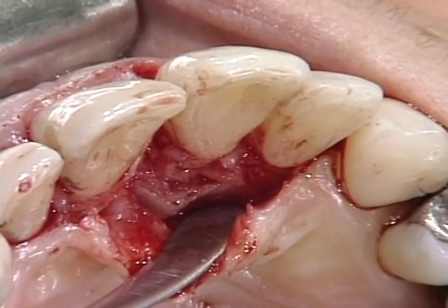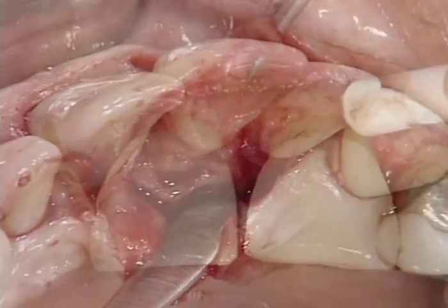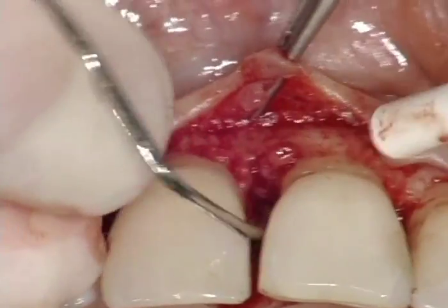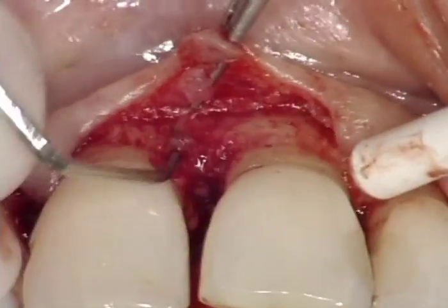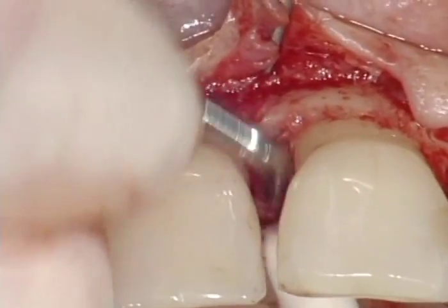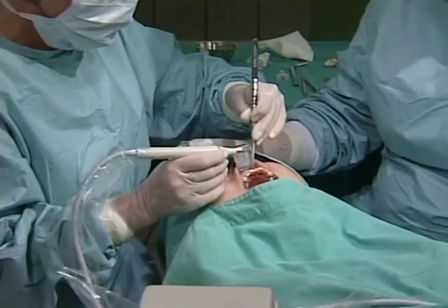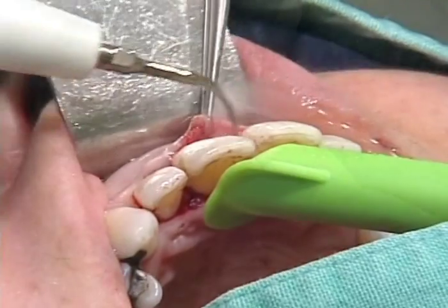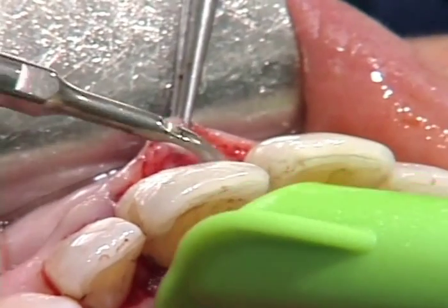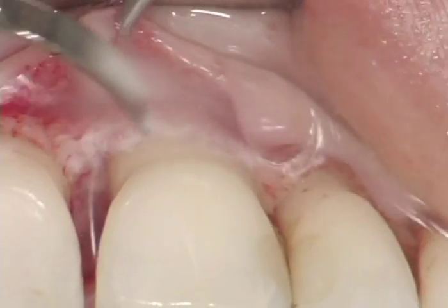For accurate treatment, good access to the periodontal defect is important. Granulation tissue attached to the alveolar bone and any associated osseous defects must be removed with a curette. This removal also provides full root surface visibility and access. Ultrasound is used for further root surface cleaning. Any calculus or plaque has to be completely removed. The surface cleaning could also be carried out with a curette.